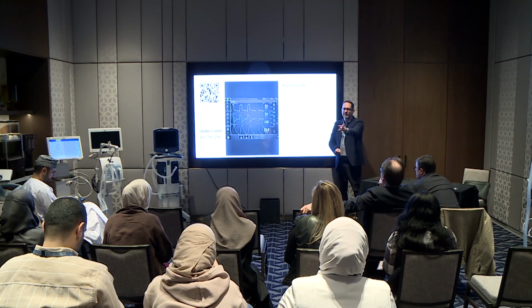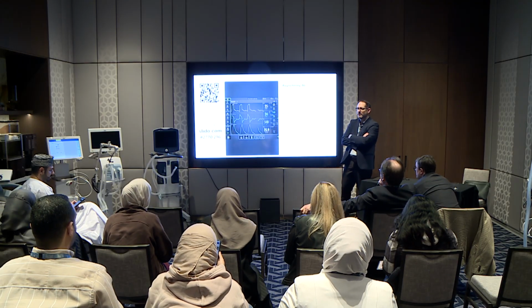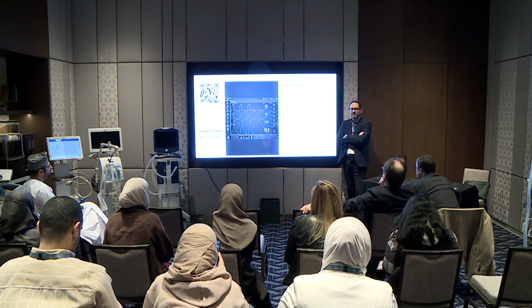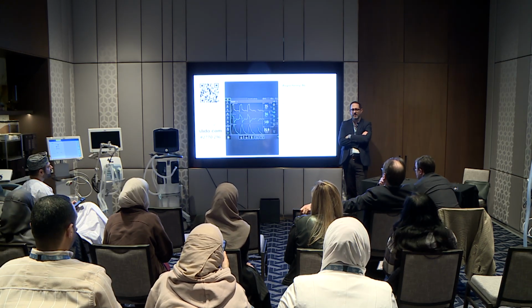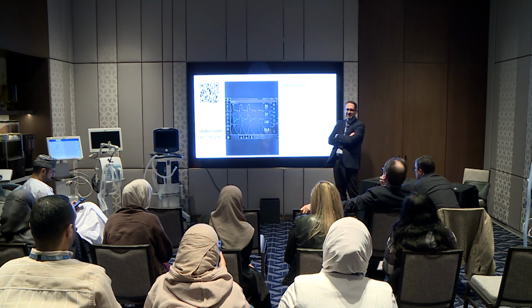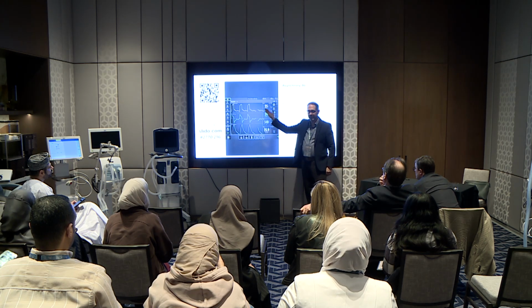Okay, so the question, I think the description is in the, can someone read out the description? What can you say about the patient's respiratory rate? The patient's respiratory rate, keyword is patient's. What can you say about the patient's respiratory rate? That's the trick question. Again, here's the respiratory rate on the ventilator.